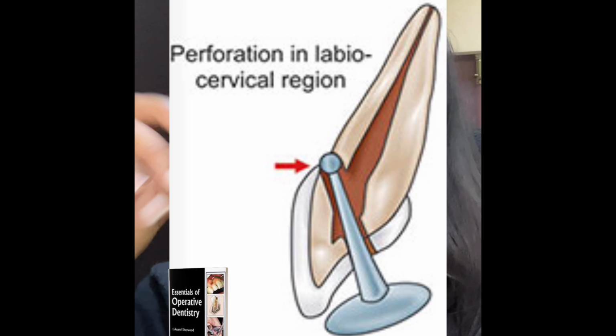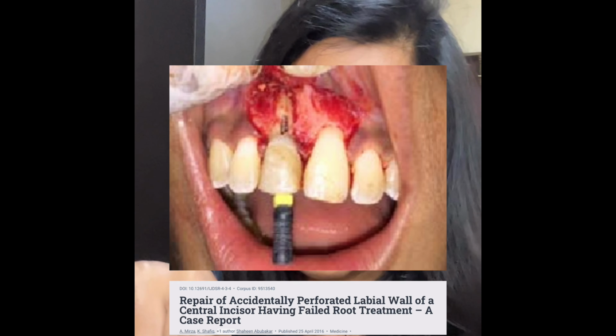Another thing that you commonly observe in central incisor access opening is that many people, especially in the early stages of root canal treatment, face buccal perforation. That is, the file goes into the buccal space and the bur also perforates and access opening goes in the buccal direction.